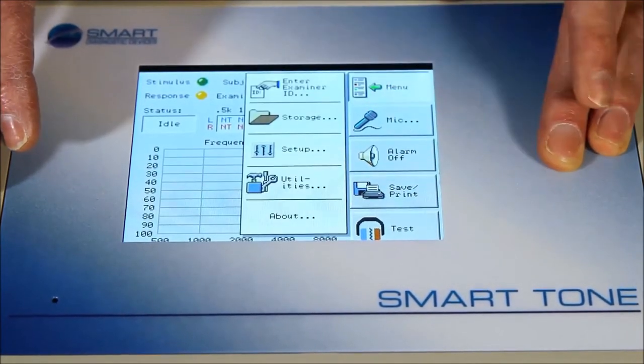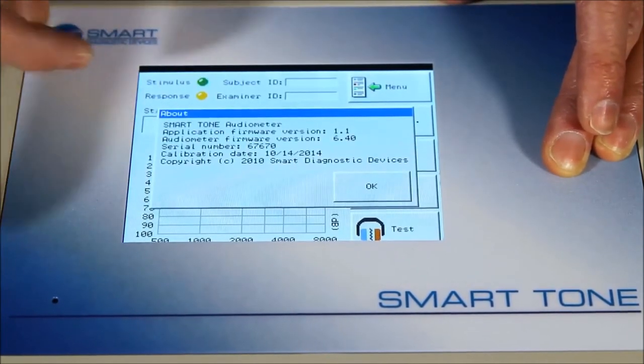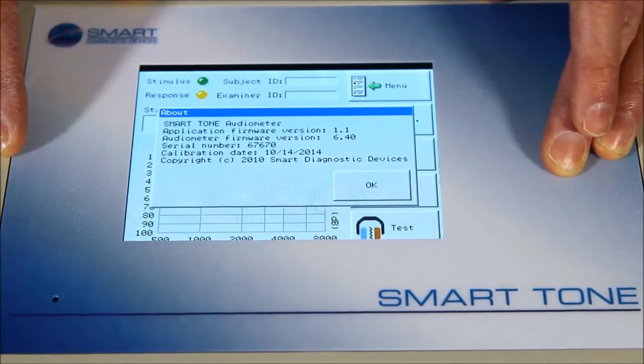The high-level menu screen just gives you information as to what version of the product you're using, and when it was last calibrated if you weren't sure.